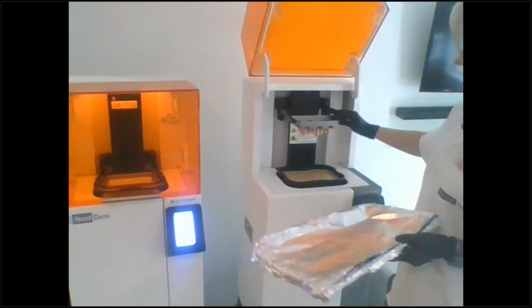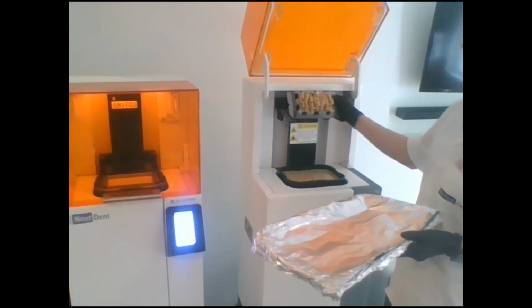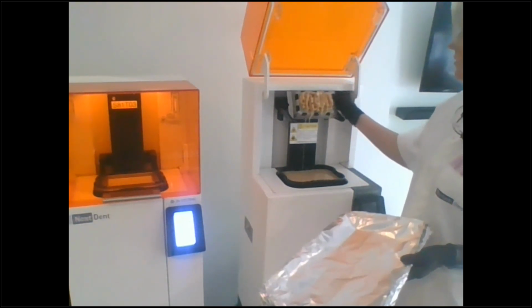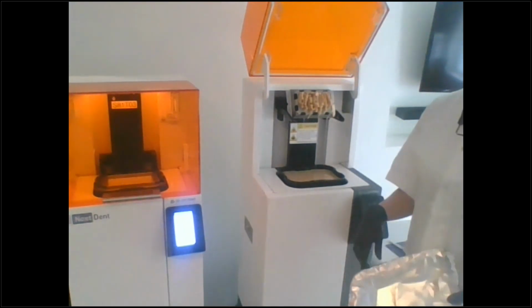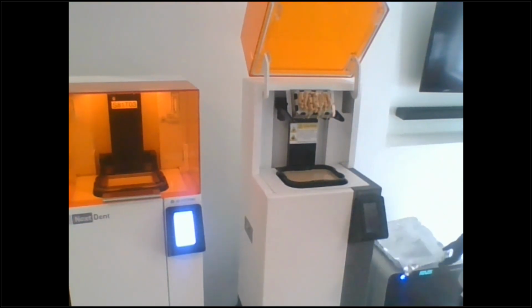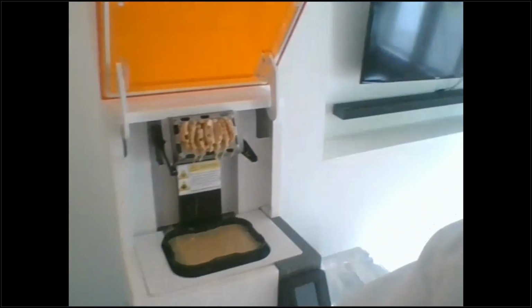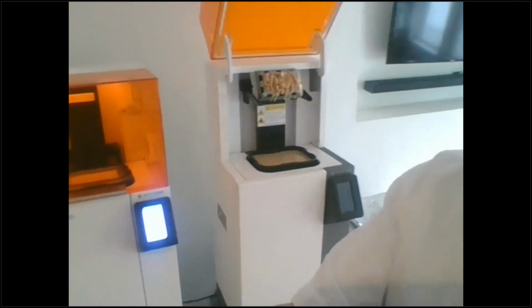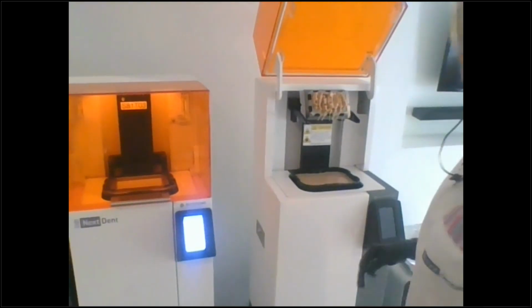And when I'm done printing, I like to put my build platform up, so this way all the extra will pour back into the resin tray. If you can see it, it's dumping out, and that's kind of nice too because I actually saved quite a bit of model resin. If you can see it all coming out, it pours out. So nothing gets trapped, and that also means you don't have to put drain holes in your models because there's a perforated build platform here.